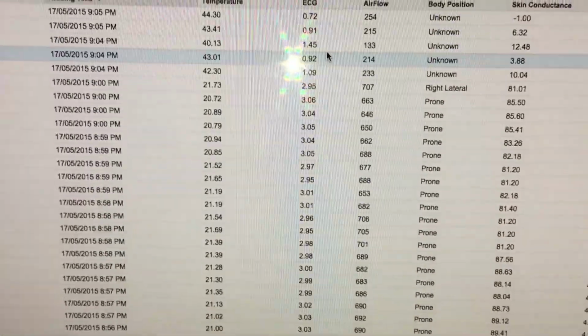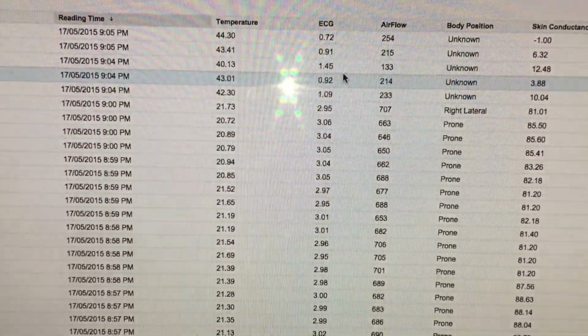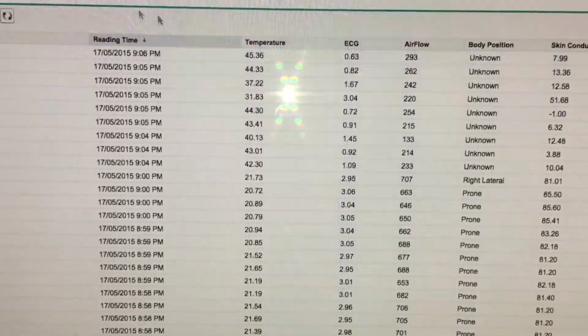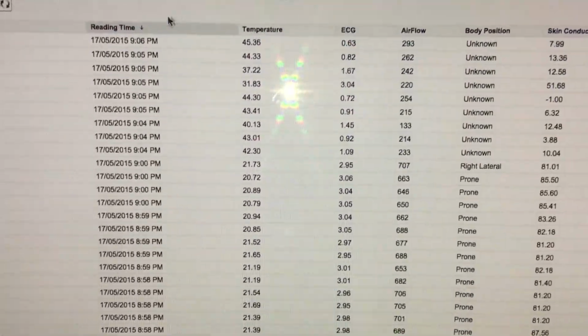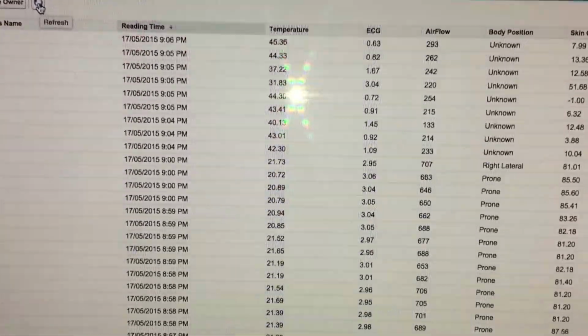Now, of course, I can go ahead and create Visualforce pages to graph it, or I can create dashboards and reports to graph it, but the heck, this was just meant to demonstrate. Here we go. I'll refresh it and you can see this data will keep changing. The time is slightly off because it's picking up the time from the US.